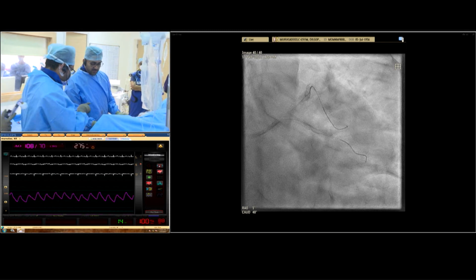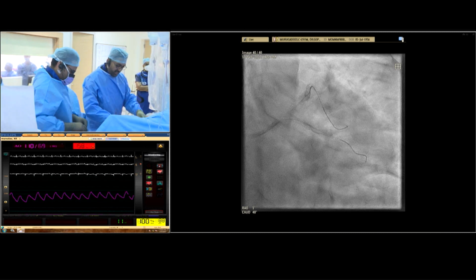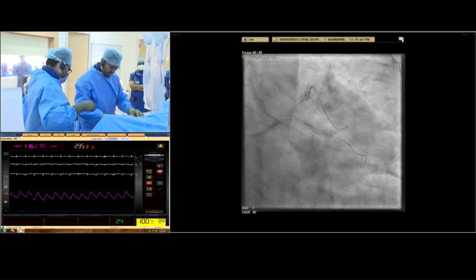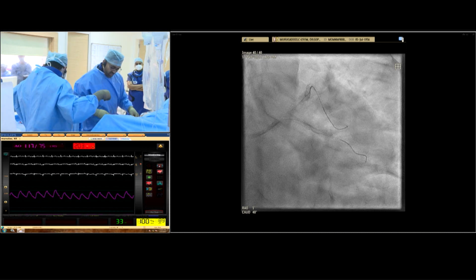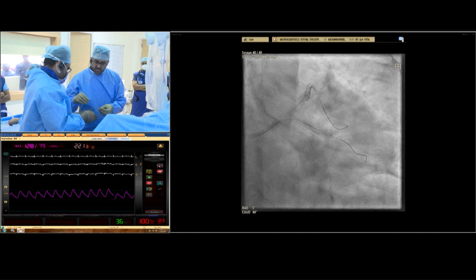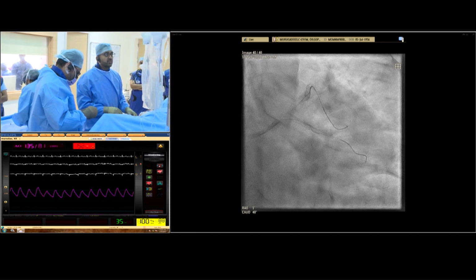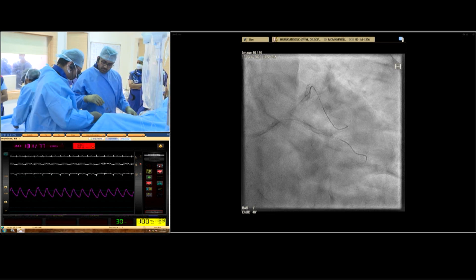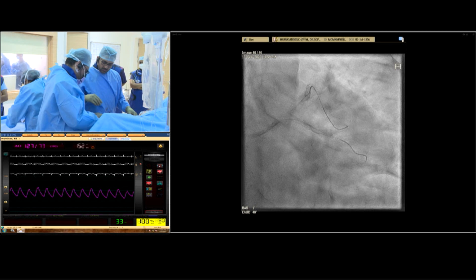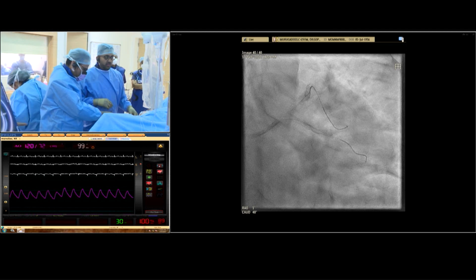That's what we used. So we'll have a look once we finish the final case, because as Dr. YVC also pointed out, after stenting, I've been very unconvinced that it makes a great deal of difference. In these types of massive calcific lesions, we have to accept some amount of compromise, so we're going to rely a lot on imaging.